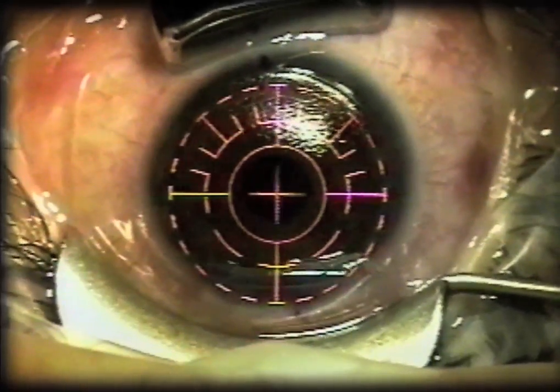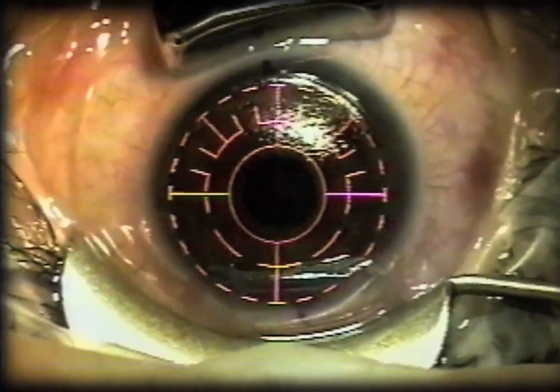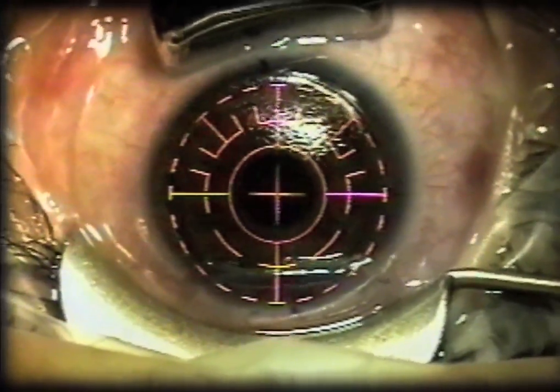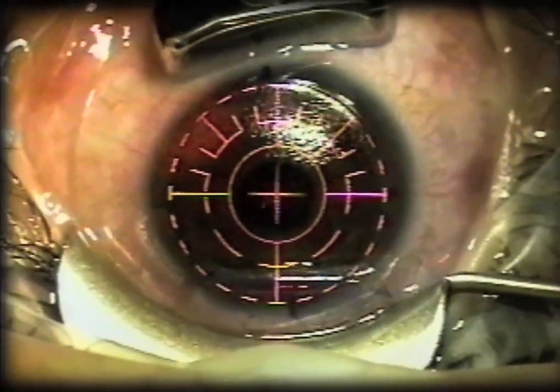You can use low suction if your microkeratome vacuum gives you a low suction option, but most of the time you just use full vacuum, the same as you would for the microkeratome ring adhesion. Depending upon the position of the eye in the orbit, you can put the suction stabilizer superiorly or inferiorly, as is shown here.